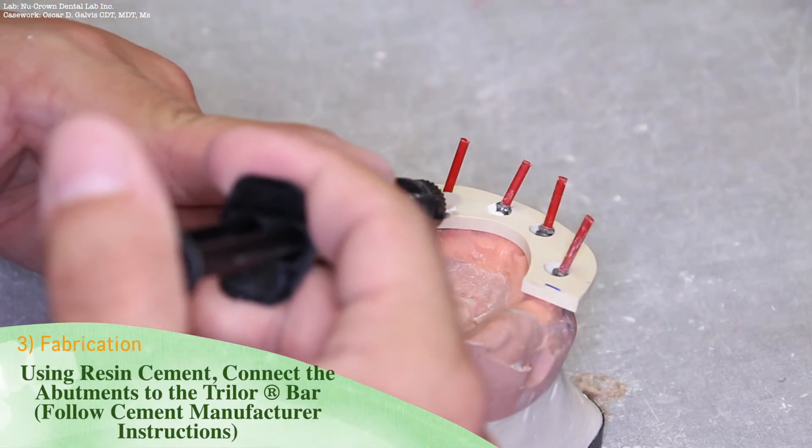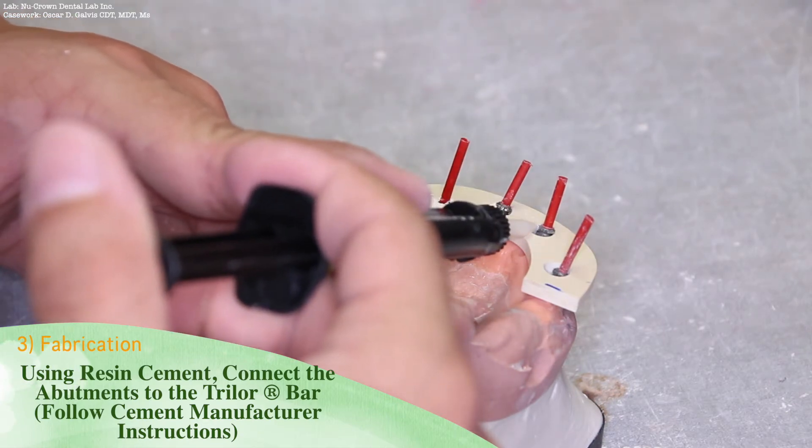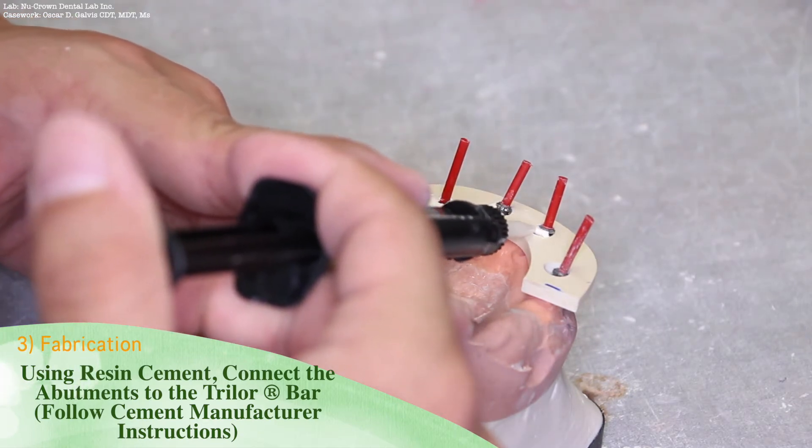Using resin cement, connect the abutments to the Trilor bar. Follow the cement manufacturer instructions.